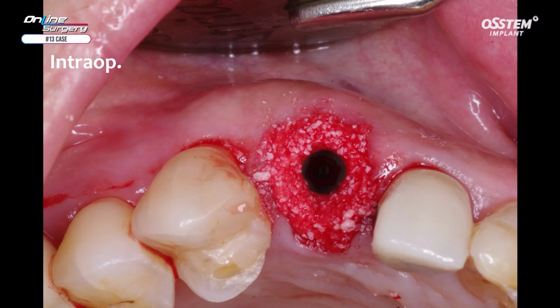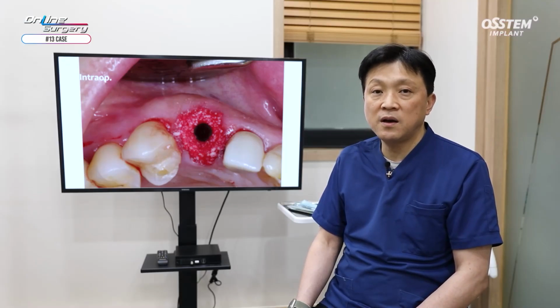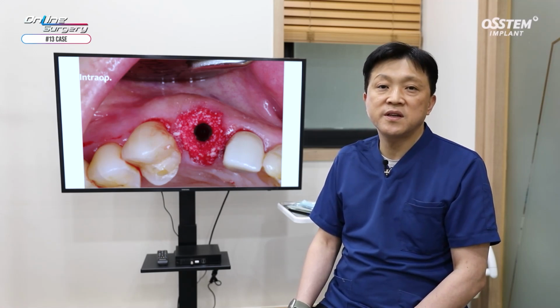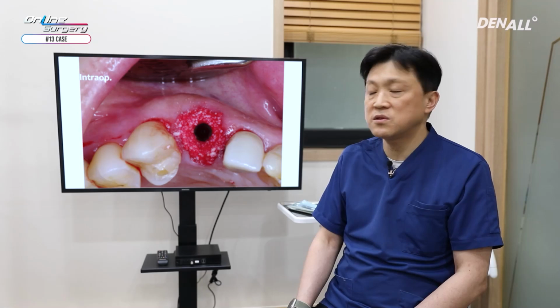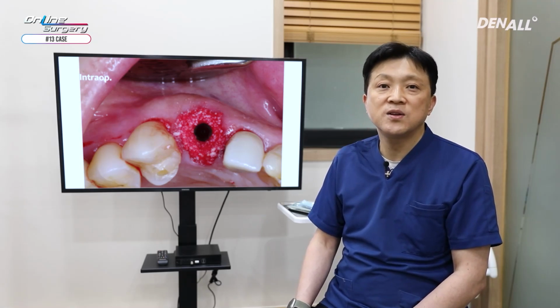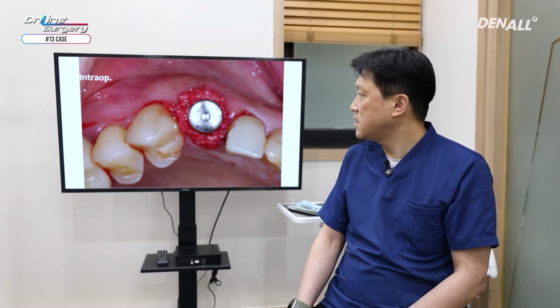This was after removal of implant driver, as you can see. Up to the gingival area, graft was done. You can have two options now. You can connect healing abutment or provide immediate provisional restoration. In principle, it is better to provide provisional restoration. However, the patient did not really want that. Therefore, healing abutment was connected.